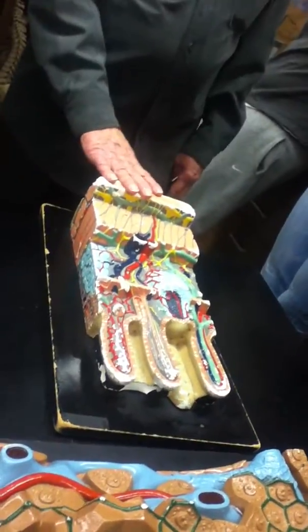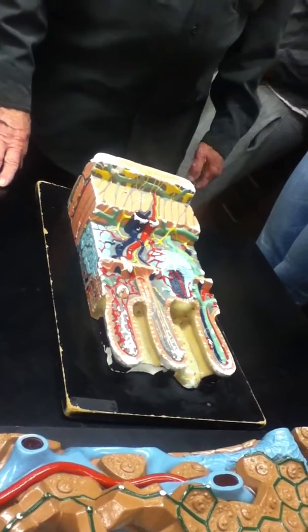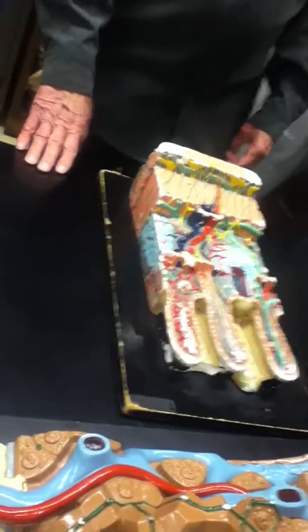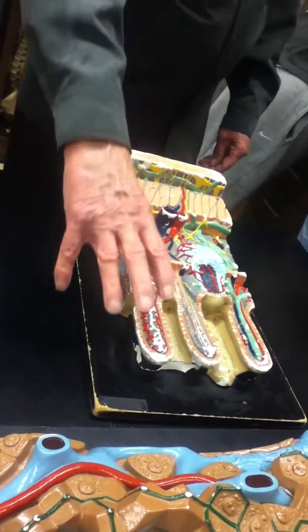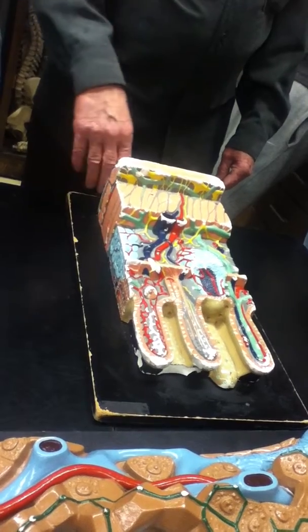Of the small intestine. Actually, of the jejunum of the small intestine, but small intestine is good enough for you to know. And you remember that the small intestine, as well as the rest of the digestive tract, is basically made up of a mucosa, a muscularis, and a serosa.